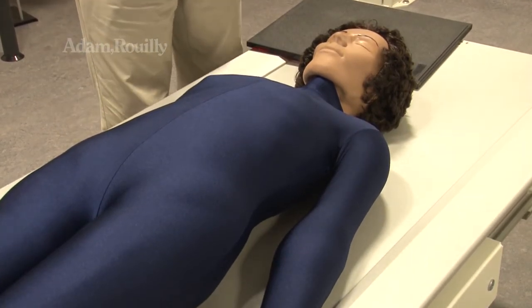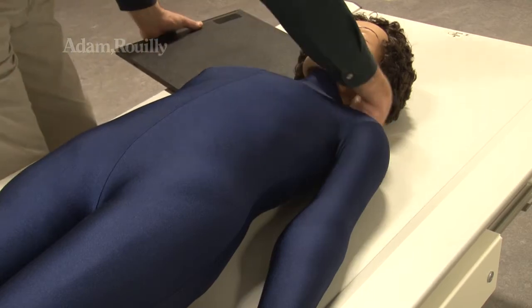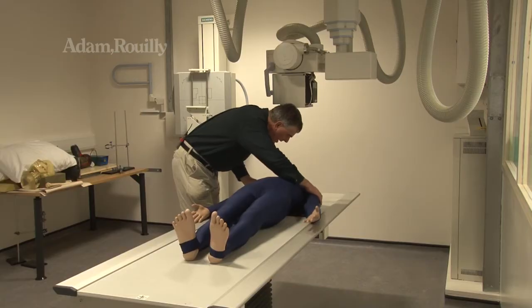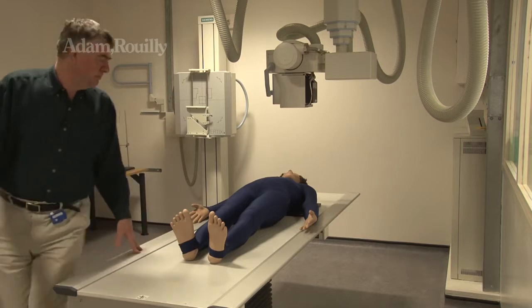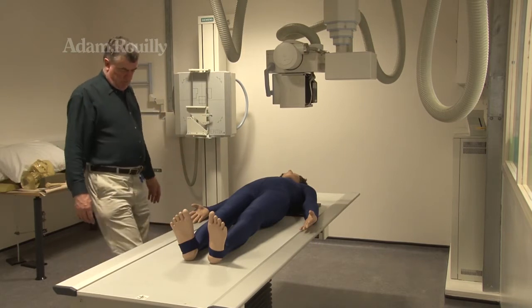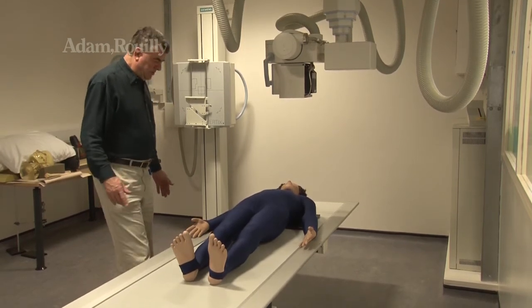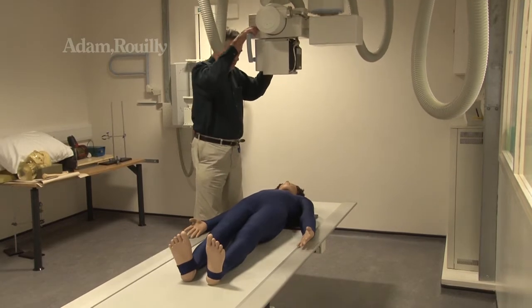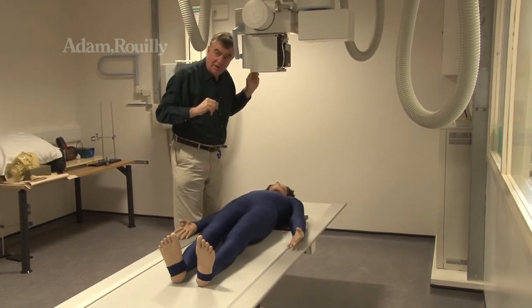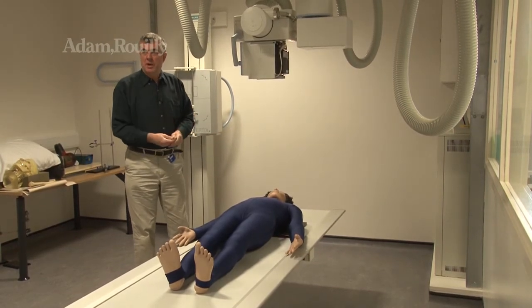So again, as I would with a patient, except this patient doesn't talk to me, so it makes life a lot easier sometimes. But we're going to make sure we get the patient symmetrical, that the area of interest is included, that they're straight. And this time, I make some adjustments to the distance that I use to reduce magnification. I won't go into the physics of that, but I like to keep the magnification in the images to a minimum. And that's a general principle of radiography. So I'm not doing anything special here because it's a phantom. This is exactly what we would do with a real patient.